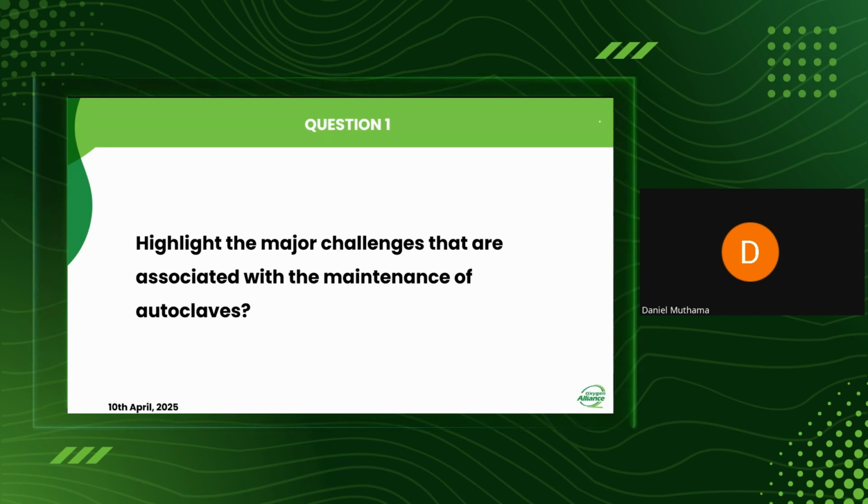On that metallic part, you need to put what we call Teflon thread, and then run it through using your hand in the clockwise direction. After you have put that Teflon thread, that is the time you put the gland nut. That will ensure there will be no leakage.